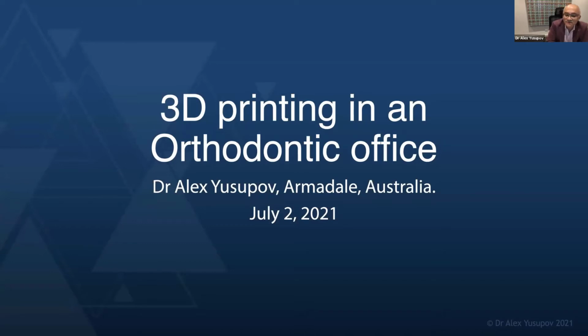3D printing in our office is a relatively recent addition to our workflow. We've been using 3D technology for about 8 years, fully utilizing it probably in the last 5 years, and doing a lot of printing probably in the last 2 or 3 years, with just about 2 months ago going completely alginate and plaster free, largely thanks to ASIGA printers and how easy they make things for us to use.